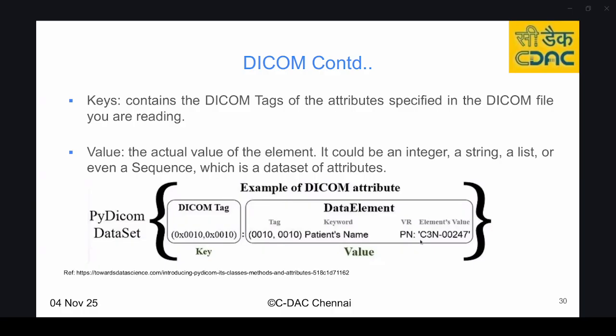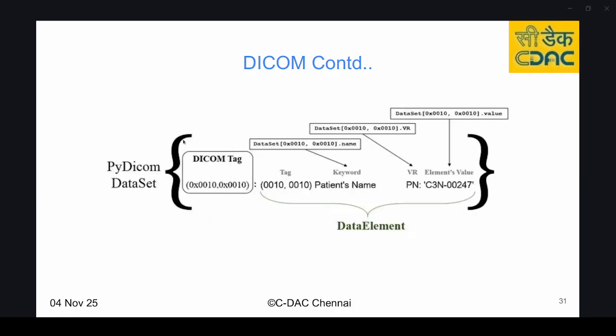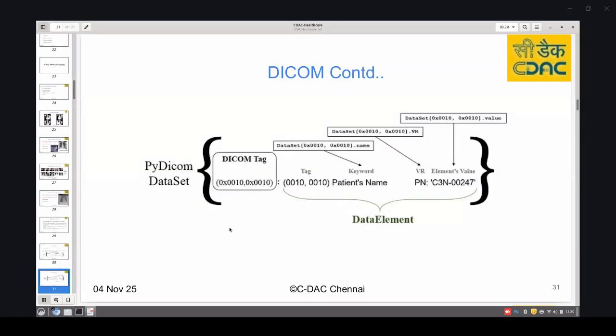So DICOM is a format where parameters related to X-ray can be represented in the form of tag, keyword, and value pairs.